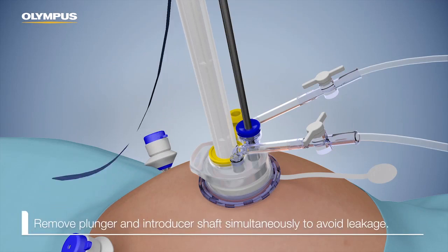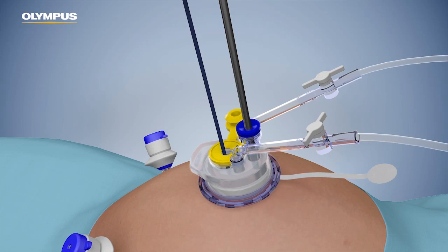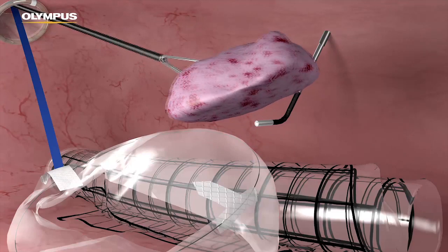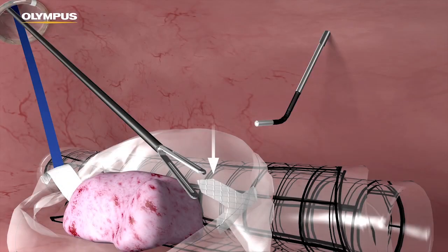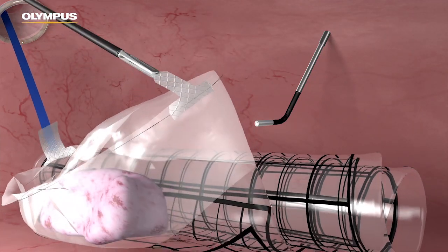Remove the plunger and the introducer shaft simultaneously to avoid leakage. Ensure the free end of the tether remains external to the abdominal cavity throughout the procedure. Position the target tissue in the pneumo liner using an atraumatic grasper. The collar can be grasped to ensure encapsulation without damaging the pneumo liner. Pulling the distal tab up and slightly over the tissue helps ensure capture.